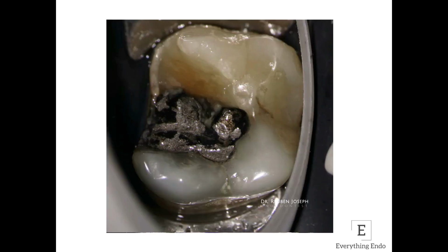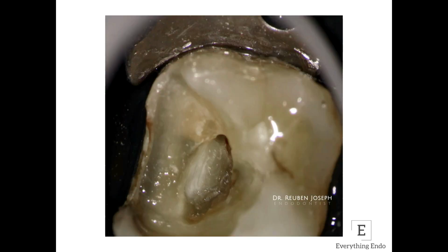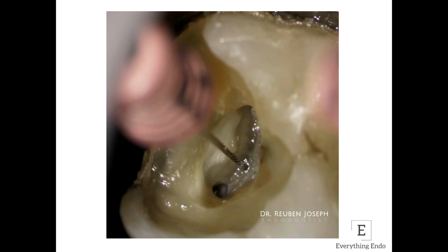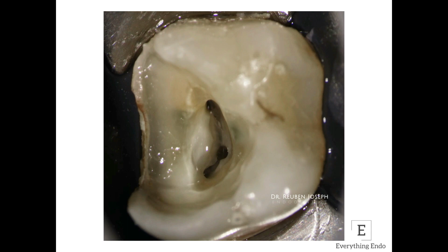This is the very same tooth with a very heavily restored amalgam restoration. On removing the amalgam restoration, we find that all the canals are actually calcified, with just a tinge of blood indicating the location of the palatal canal. Then I go and locate the MB canal in the most probable location. And then I go for the distobuccal canal.